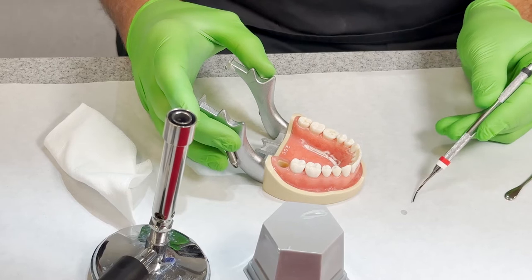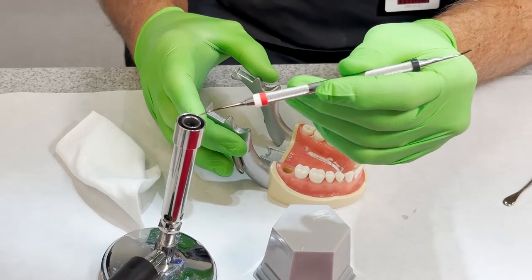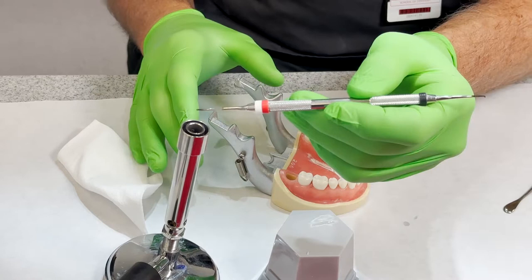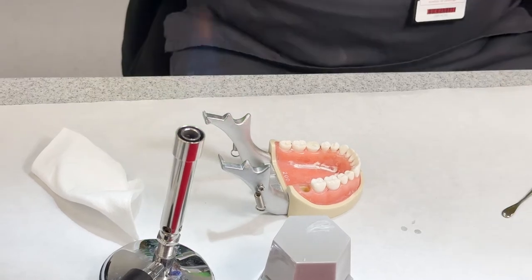Okay, I don't know if you see that, but if you're having a hard time getting it to the tip of the instrument, heat behind that, and that will distribute it to where you want it, okay? Does that make sense? Okay, let me see if I can.